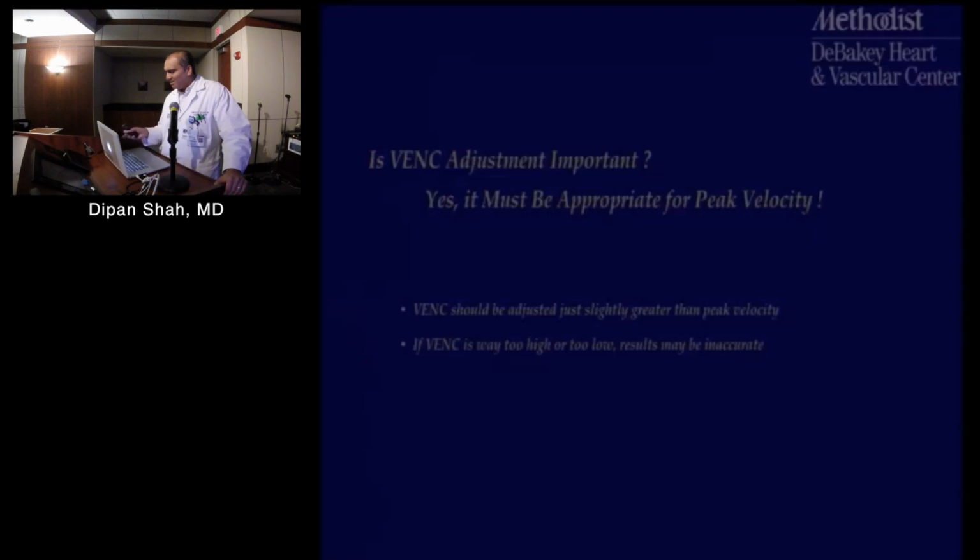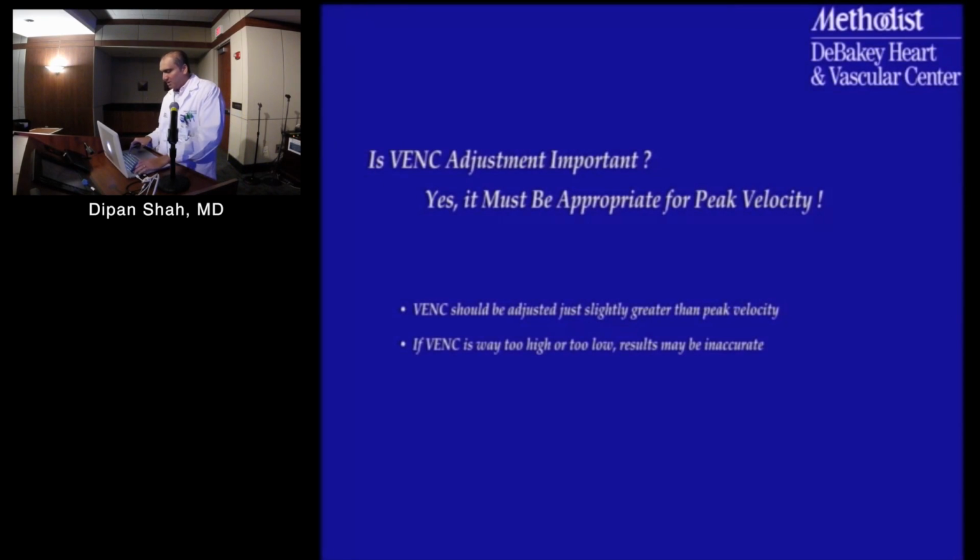But the magnitude of the offset errors now, I think, is not as much as it used to be in the past. One of the reasons is that those errors can occur if the vessel you're imaging is further from the center of the scanner. With pretty much most scanners available now, if I'm picking an imaging plane at this location, it will automatically move the table so that my imaging plane is at the center of the scanner. So that reduces some of the error. Obviously that can't reduce the error left to right, or anterior to posterior, where you may not be in the center of the scanner, but trying to do this background correction is one of the ways that you do that.